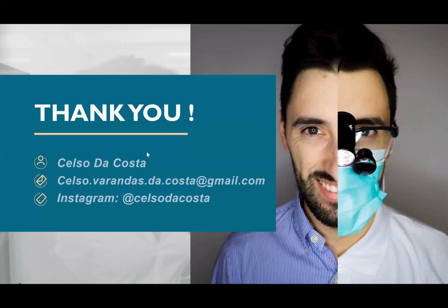And until now, I had really good results. So I think I'm gonna keep doing it. But it's always the most important thing: communicate with the patient, explain the unpredictable results and the presence of white spots that can be a little bit whiter for a while after the whitening. Yeah. And just advise the patient, and the patient is gonna make the choice.